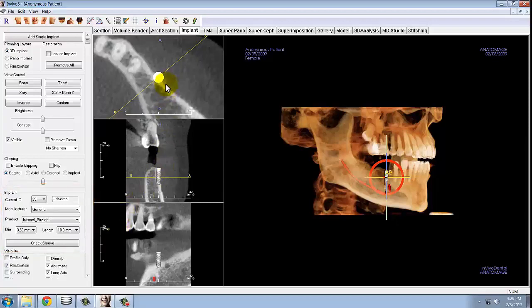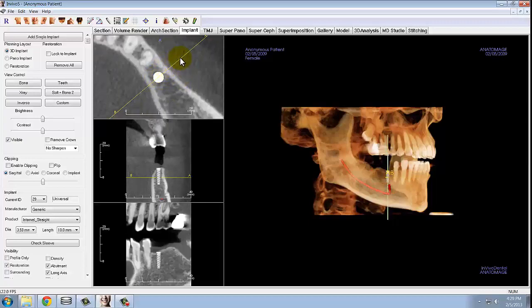Use the Axial Cross Section located at the top left of your rendering window. You can click and drag the implant bodily so that it is in the crest of the bone. Move the AB line so that it is at the crest of the bone so you can use the measurement tool to measure out the distance between the implant and the adjacent teeth.